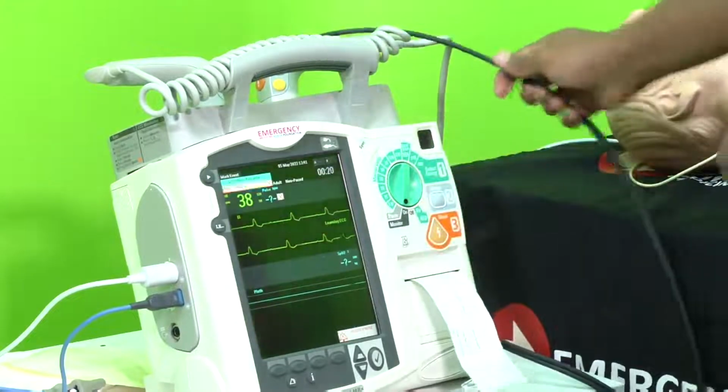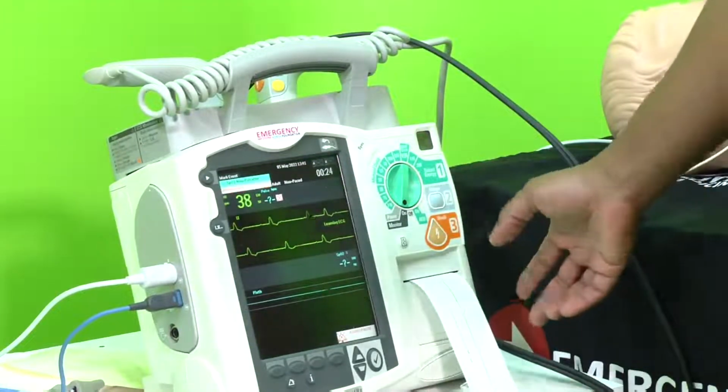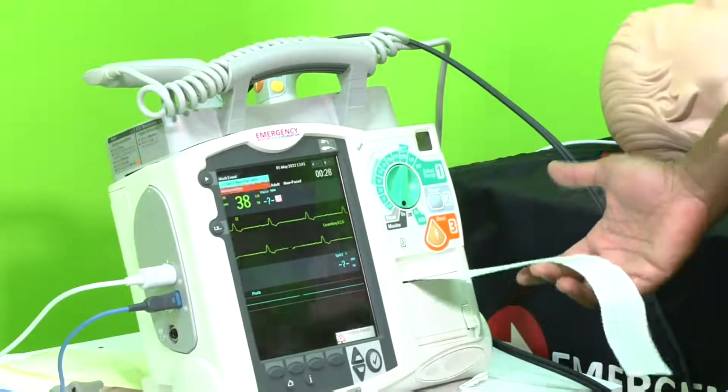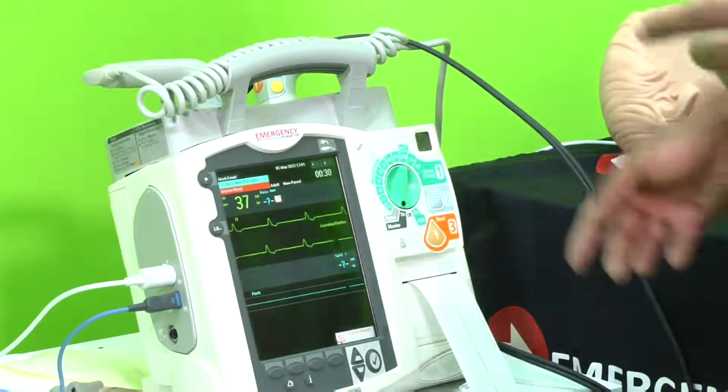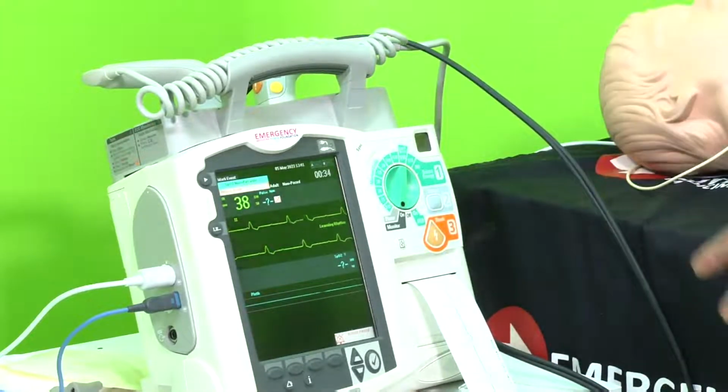At this point, it's very good to get a rhythm strip from the monitor, or get a 12-lead ECG if possible, to see what the underlying rhythm is. I know you had the ECG sessions before that discussed the different types of ECGs.